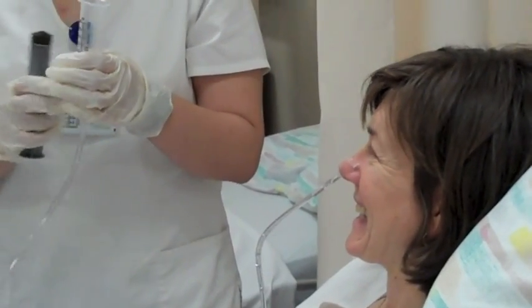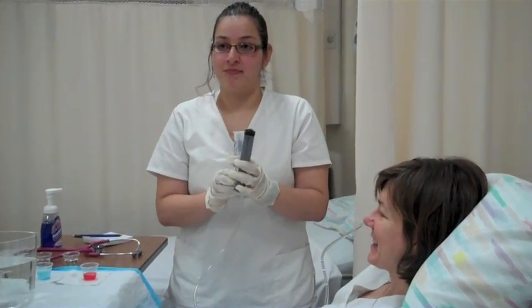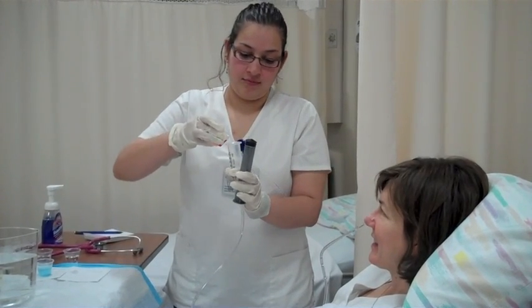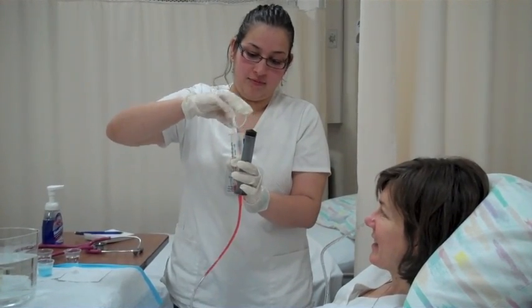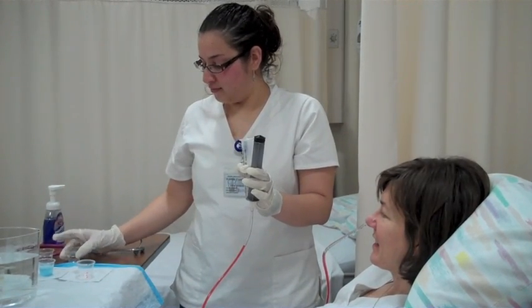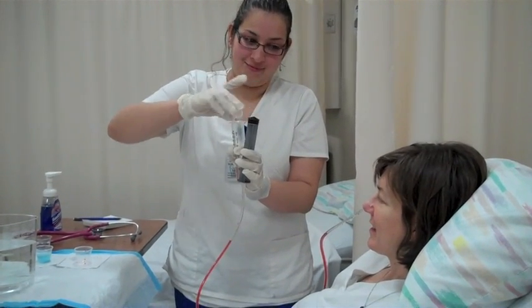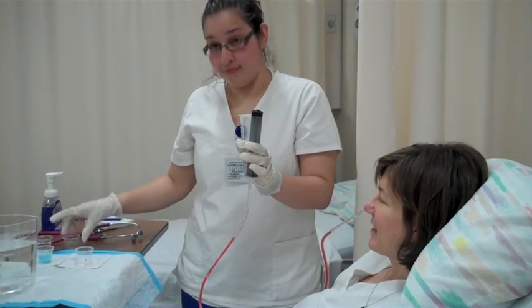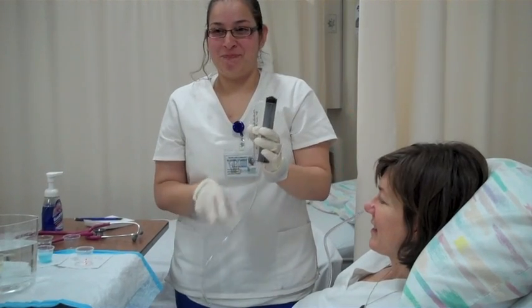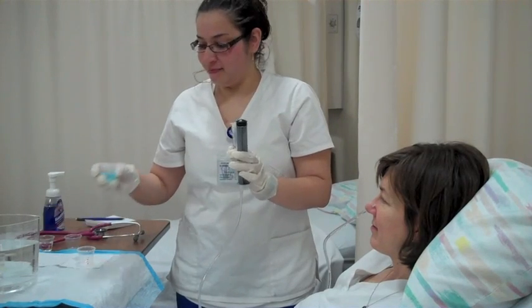Step 7. After flushing, medications are ready to be administered. Administer the first dose of medication by pouring it into the syringe. Follow this with a 5 to 15 milliliter flush of water. Continue administering medications one at a time while flushing in between each dose.